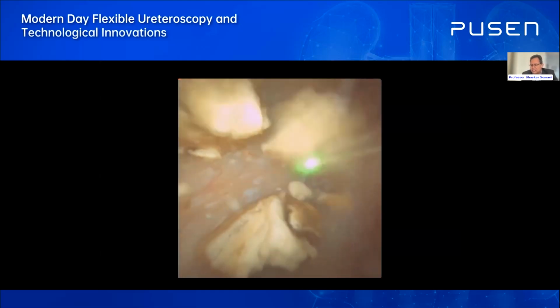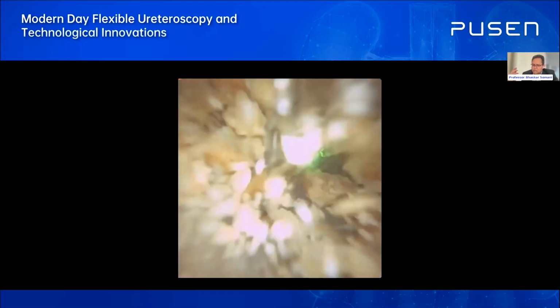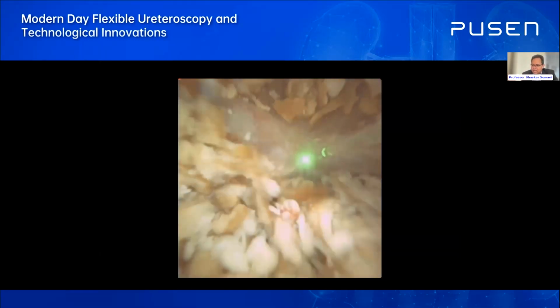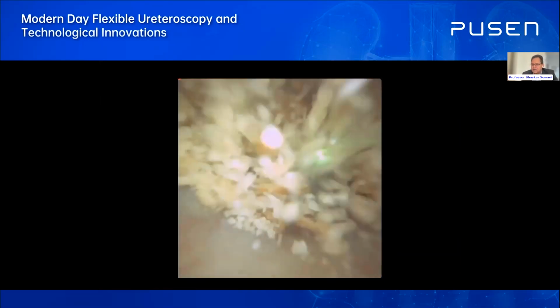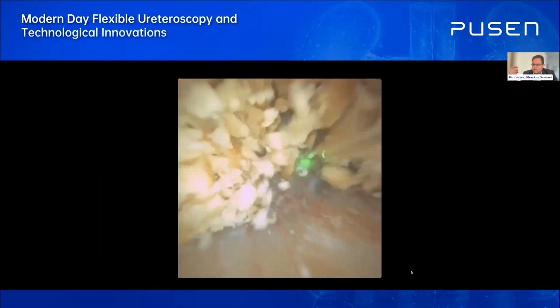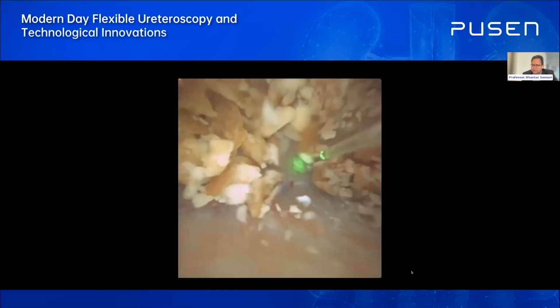So what is the downside, if any? I think you need to have more irrigation fluid, because as you're sucking, you need to have fluid. So you need to be prepared for that. I still think we don't fully understand the optimal values of suction and so on. And that is something that in time we will understand better. And here again, normally when you do this, you have some dust and debris. But because I'm using intermittent suction, the view completely clears. I'm not having to stop and start, which is what you very often have to do.